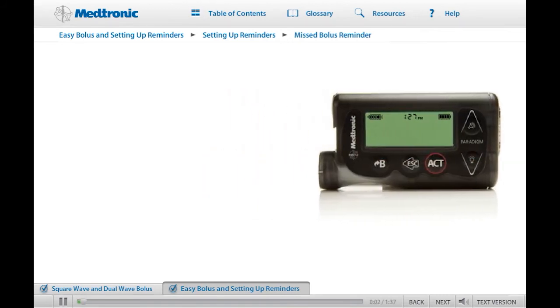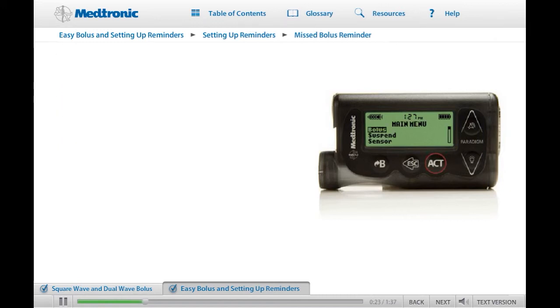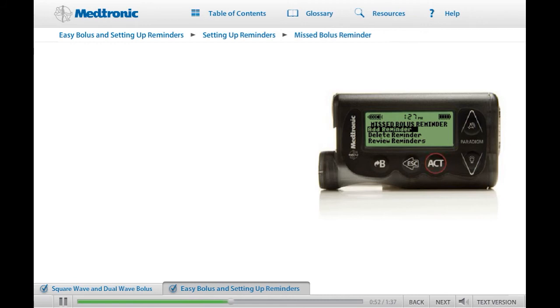The Missed Bolus Reminder feature is designed to notify you when you do not deliver a bolus during a specified time period of the day. You choose the time period and set a start and end time for each time period that you want to be reminded to give a bolus. The pump arrives from the factory with this feature turned off. To turn this feature on, from the main menu go to the Bolus menu and press Act. Select the Bolus Setup menu, press Act, then scroll down and highlight the Missed Bolus Reminder. Press Act and select On Set and press Act. Once the Missed Bolus Reminder option is turned on, you can add, delete, and review Missed Bolus Reminders.